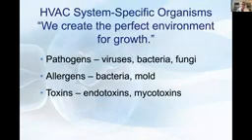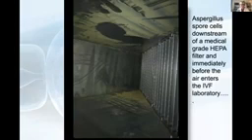In IVF, we create the perfect environment for growth: perfect temperature, perfect humidity. So therefore, a lot of your airborne pathogens, allergens, and toxins are also going to continue to proliferate. I want to show you, unfortunately, we see this far too often. This is an image taken by my colleague, Eric Marsh, downstream of a medical grade HEPA filter, and just about 1 foot from where this ductwork is going to have the air enter an IVF laboratory.